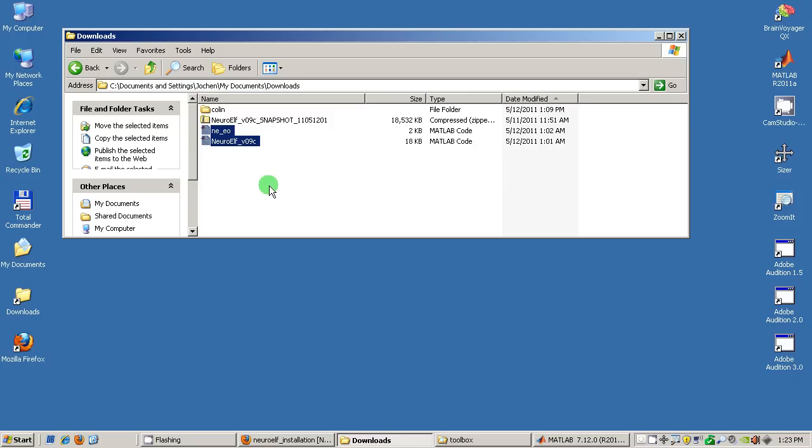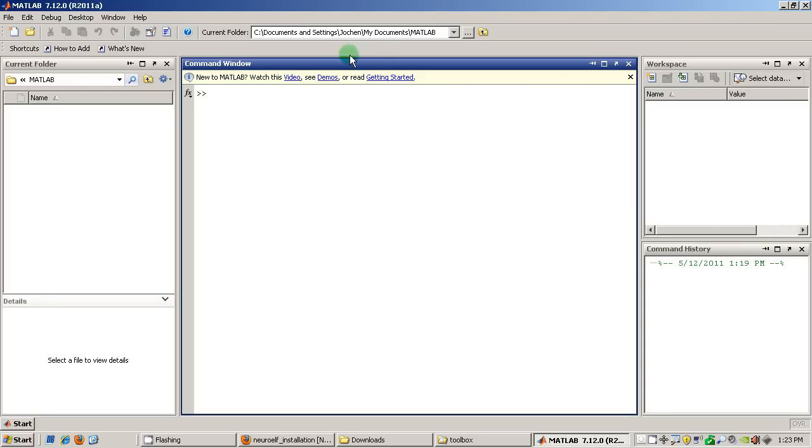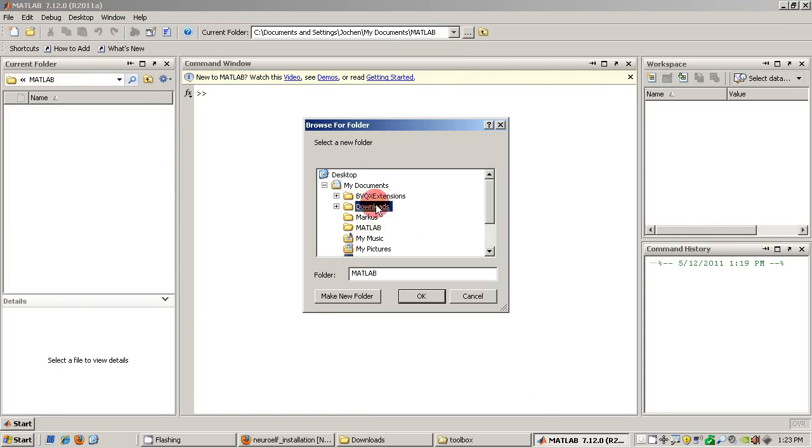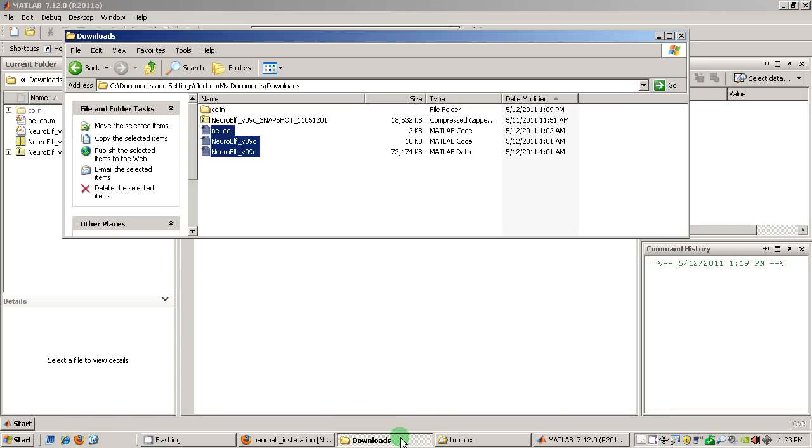And the important file to use is the file called NeuroElf underscore V09C which is the installer. And so I am now switching to MATLAB and picking the same folder which is the downloads folder and I can already see those files. Now it informs you that it's done with unpacking.